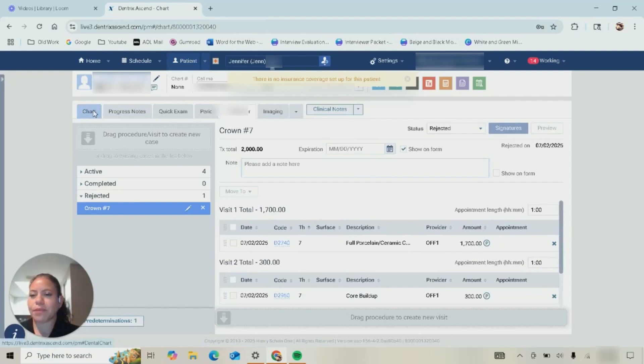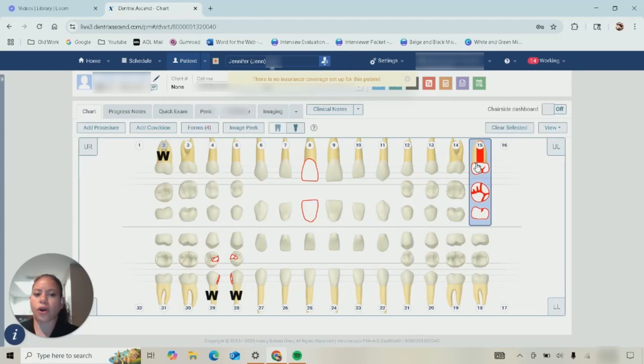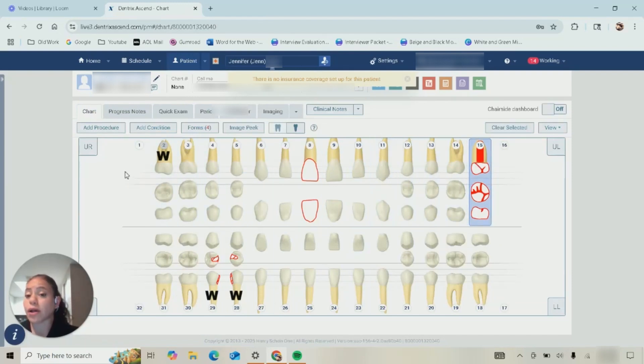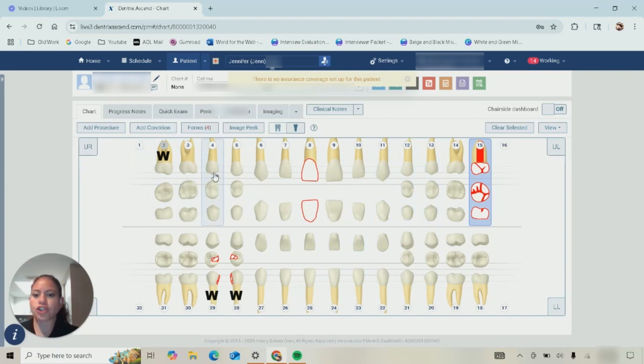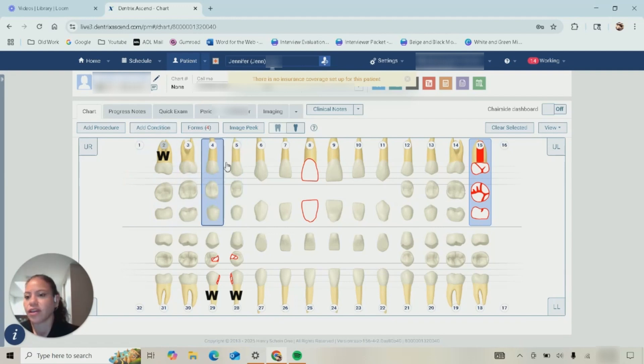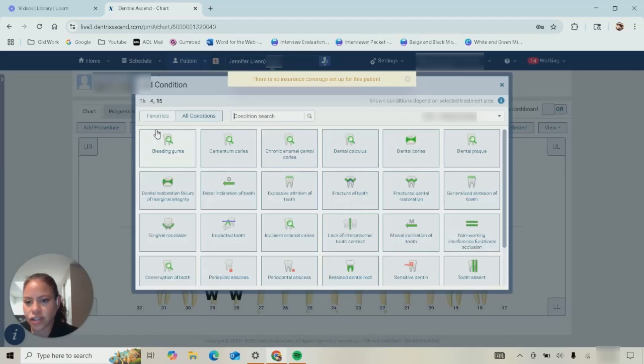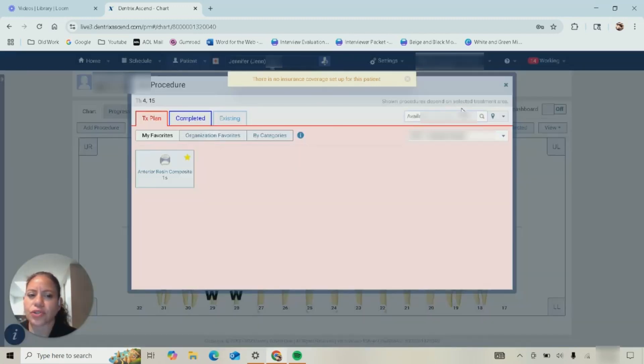Now something to always remember is if you are going to do a treatment plan for the patient, if possible have your assistant properly chart the patient. Because if you need to do a bridge between three and five and four needs to be missing, you would select your tooth at condition and I would find tooth absent here, and that is different from actually having the tooth extracted.